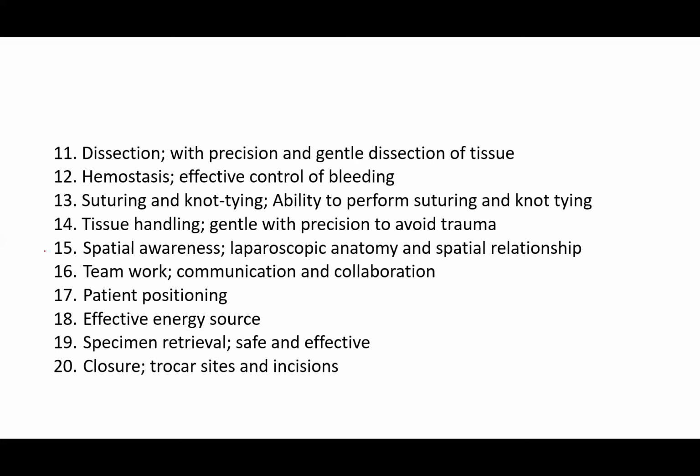You might have some difficulty in understanding the orientation when comparing what is on the camera and how the ergonomics of your hands are moving. So this is what is achieved with time and training. When you frequent the procedure, you tend to understand the ergonomics better. Then the laparoscopic anatomy and spatial relationship.